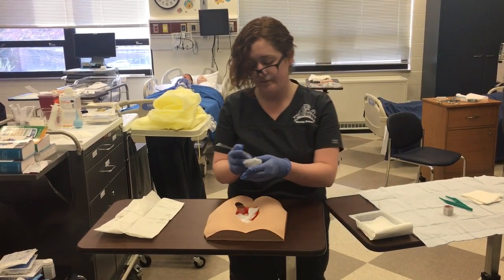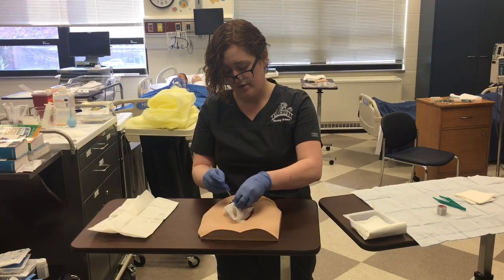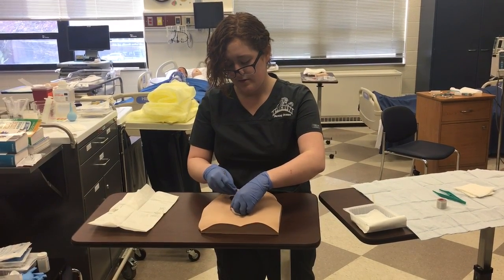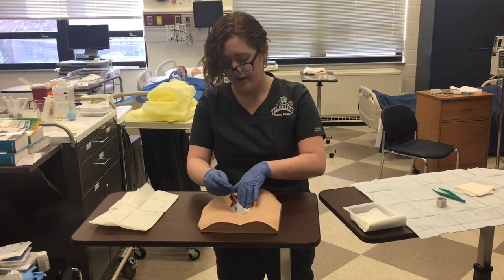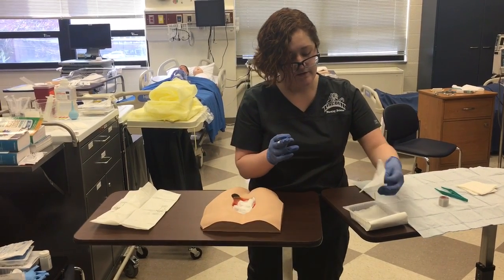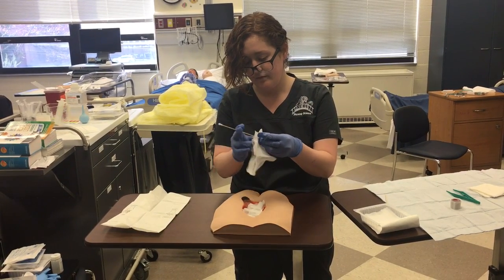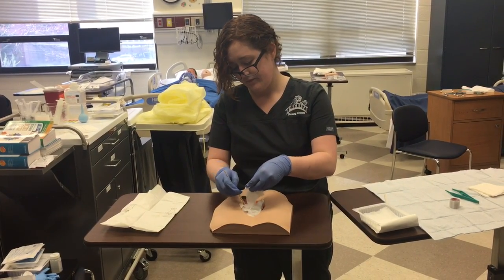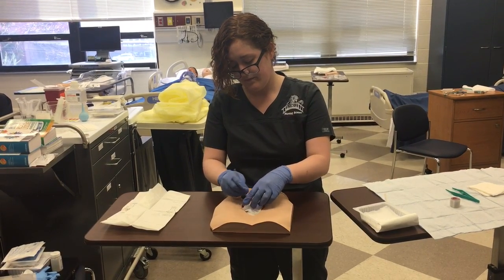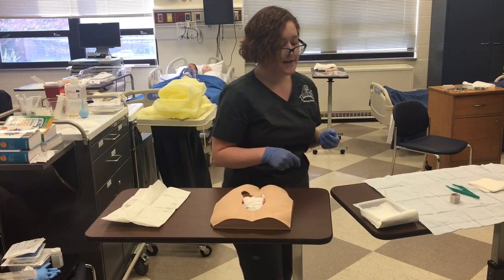Wring it out, pull it out, and then pack it. Again, making sure that you are not overpacking it. And do, I think, one more, and that should be enough. Okay. Once that is finished, I'm going to dispose of the applicator in a biohazard container.